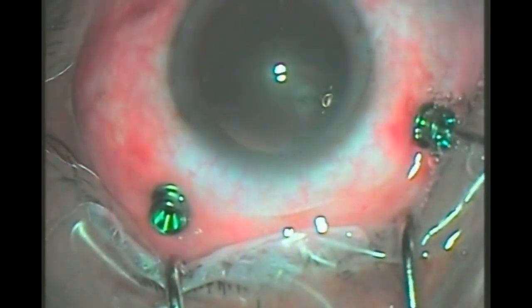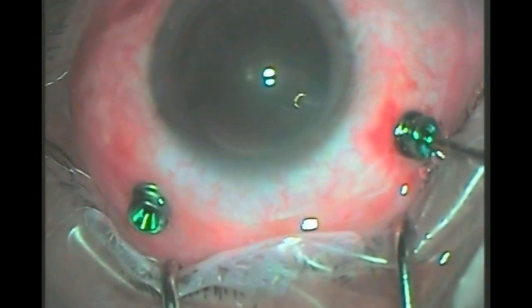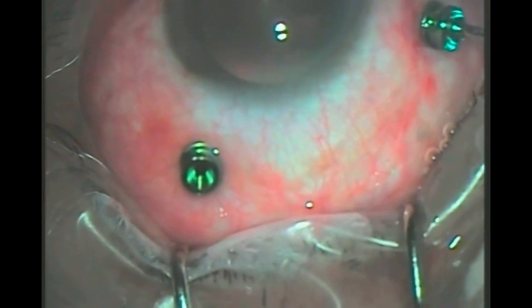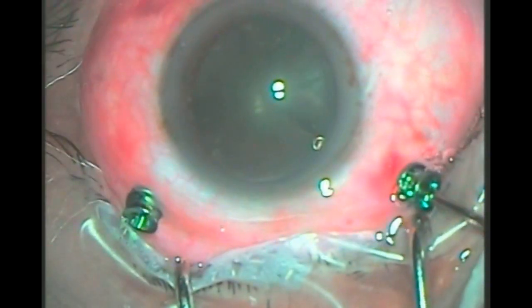With direct visualization, the anterior vitreous can be cut with the vitreous cutter under standard setting. As the surgeon cuts the bubble-stained anterior vitreous, the vitreous strands can be seen moving, which confirms adequate clearance of the vitreous layer without the fear of lens touch.